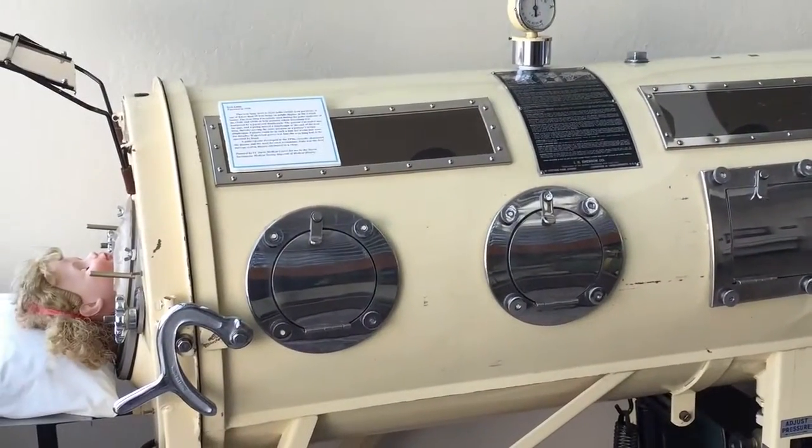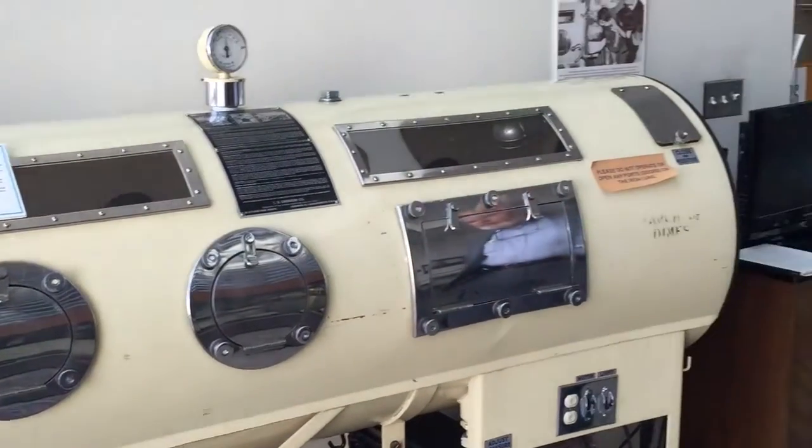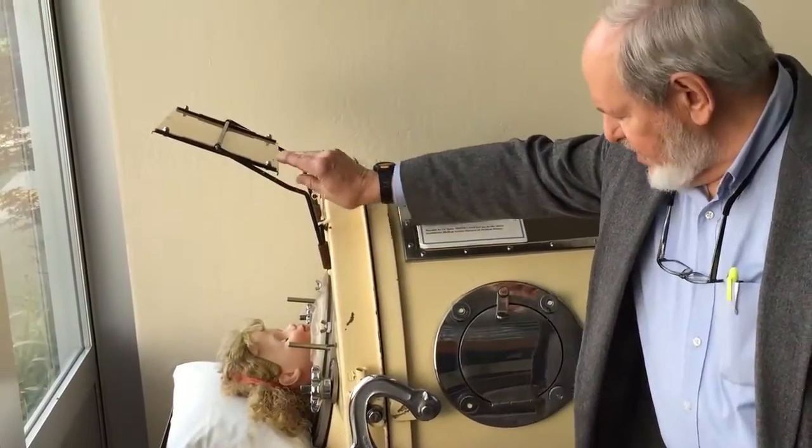Of course, you have to appreciate that these were used before the days of availability of television, so the people in there would be pretty isolated. Their hands would be within the iron lung, so they could not read books or do anything like that. Their only contact with the outside world, basically, was looking at the mirror above their head here.